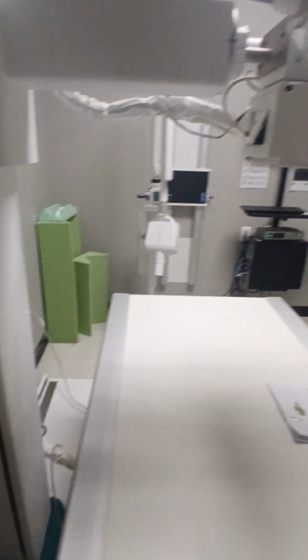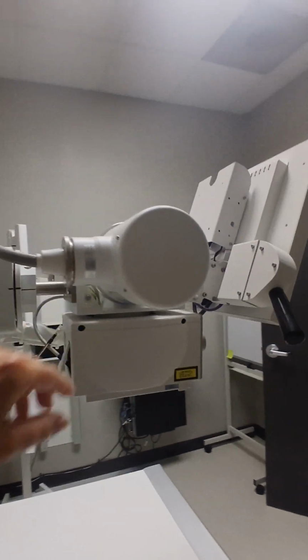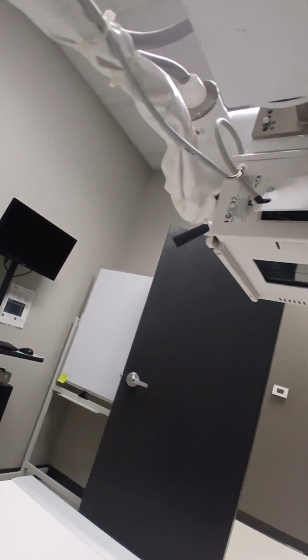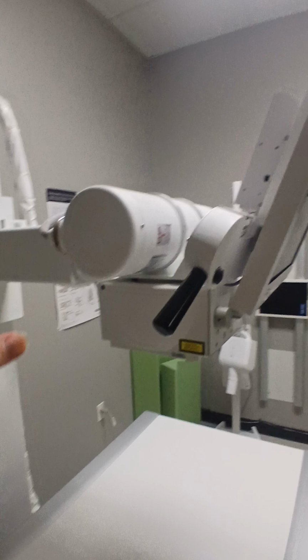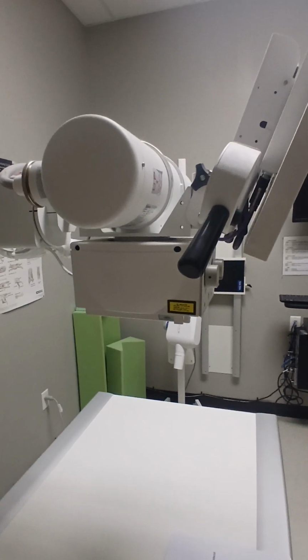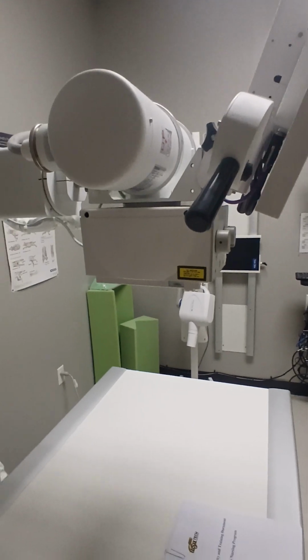And then I wanted to show you the back of our tube. So when we talk about an x-ray tube, it's this big thing here. And on the back of the tube, you can actually see that's negative. So that's gonna be our cathode. And the other side, you can't probably see it here, but that's the anode. So when we talk about how x-rays actually work, what we're talking about is what's happening inside of the x-ray tube in terms of electricity and the electrons smashing into the anode and creating the actual x-ray.